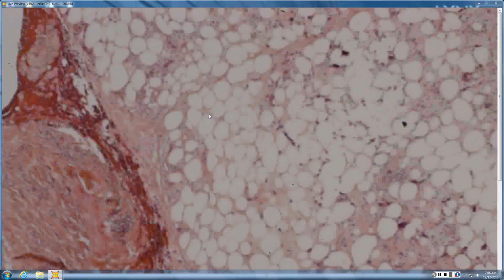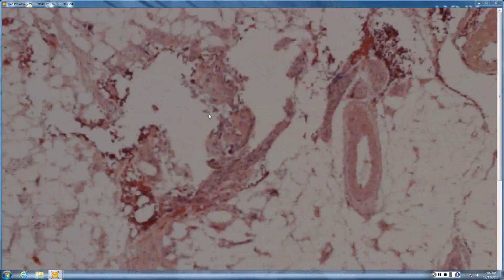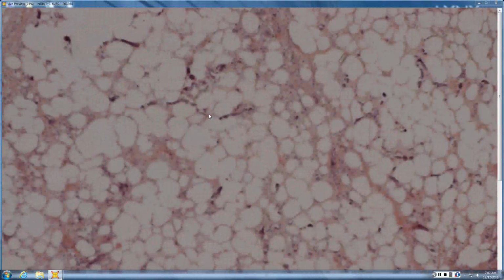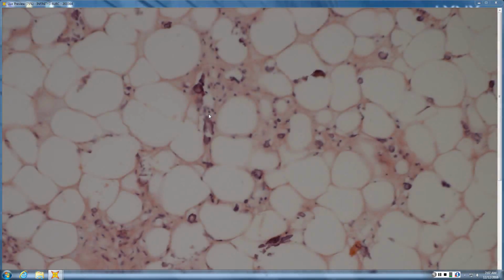Least favorite. So, this is obviously a deep biopsy, right? More of like an excisional kind of fat pad almost type of biopsy. Not typically representative of what you guys take or send. Calciphylaxis. Yeah. So, it is calciphylaxis, and you can see the calcium deposits. And where does the calcium deposit? Small. So, yeah, in the very small capillaries in the subcutaneous tissue.